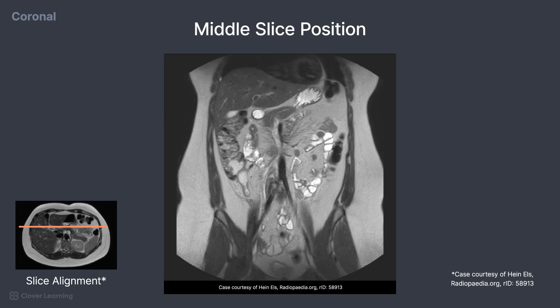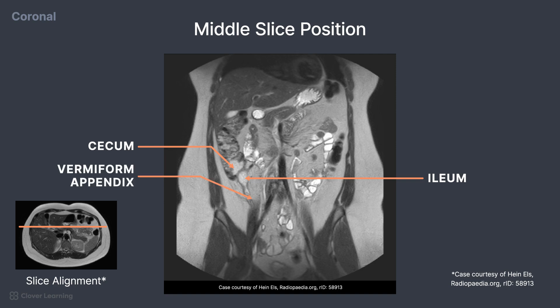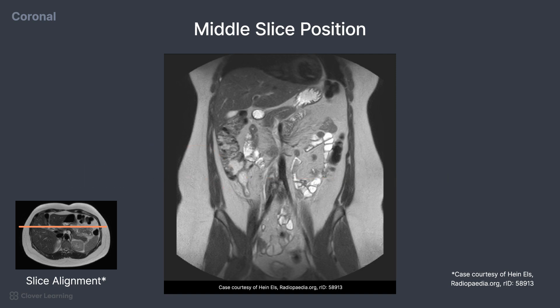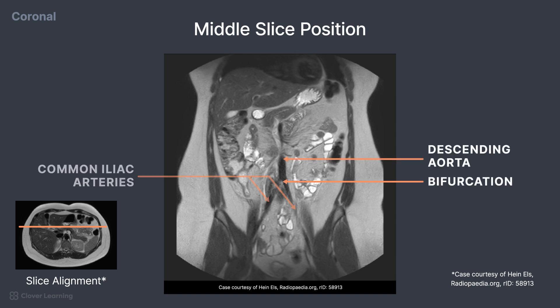Also on this image, the terminal ileum is demonstrated. This structure connects with the cecum of the large intestine. The vermiform appendix is demonstrated inferiorly. This slice also shows a portion of the vascular system, including the descending aorta and bifurcation to the common iliac arteries.